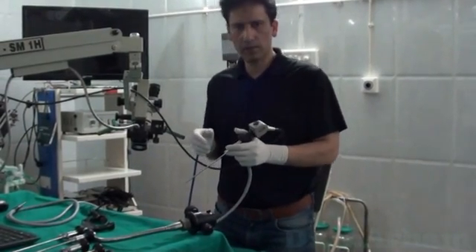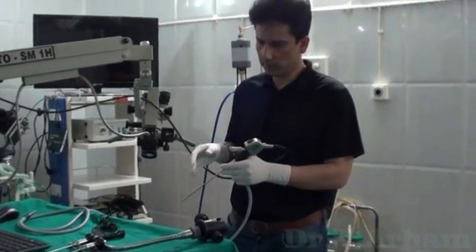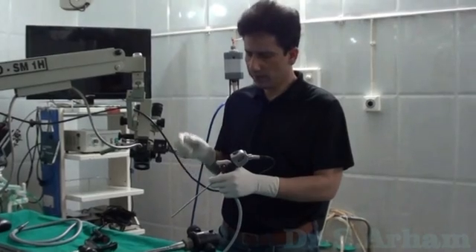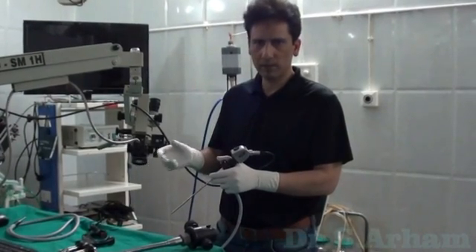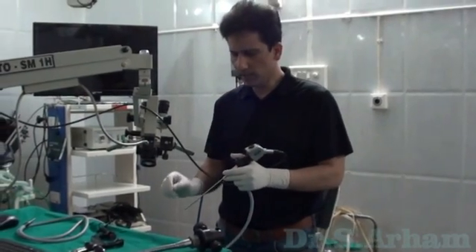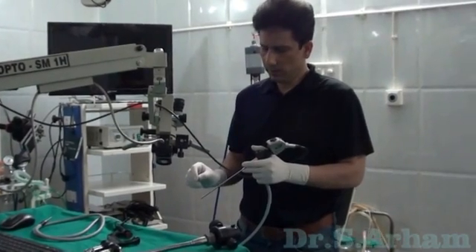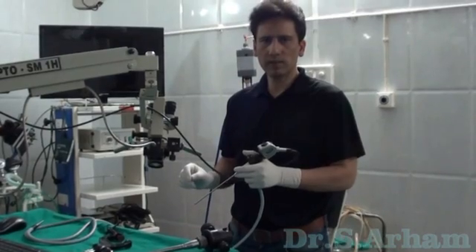Just imagine if you are doing a mastoid exploration and you are holding the endoscope like this — you have only one hand free to work. That is very difficult if you are working with one hand and you are using a drill. You have to use a suction simultaneously.